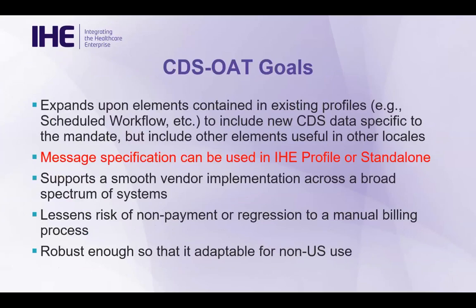So this profile, CDSOAT, makes sure that this information can flow through different systems, and it takes advantage of many of the existing profiles like Scheduled Workflow, which already define the mechanism for communicating between the order placer, the DSS order filler, the image manager, and down to the other systems.